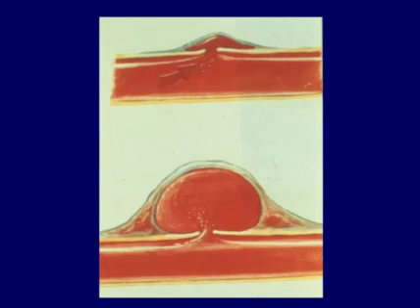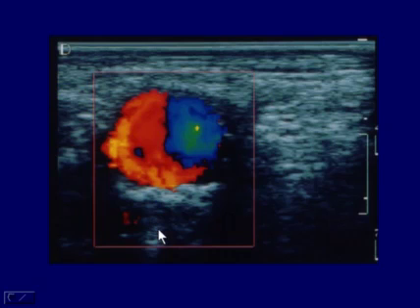We make a hole in the artery, as shown over here. We should hold pressure on it, compress it, and allow platelets to aggregate and a stable clot to form. But if we don't hold long enough, it's not going to hold, and it's going to break, and we're going to see blood extravasating outside the artery and creating this false aneurysm, or pseudoaneurysm, encompassed by some of the connective tissue around the outside of the vessel.